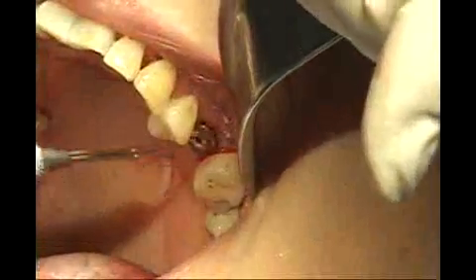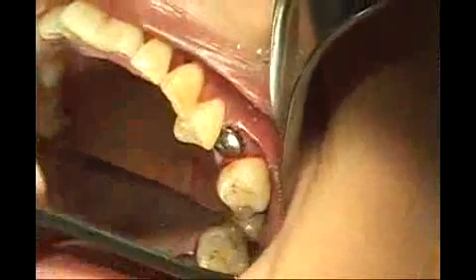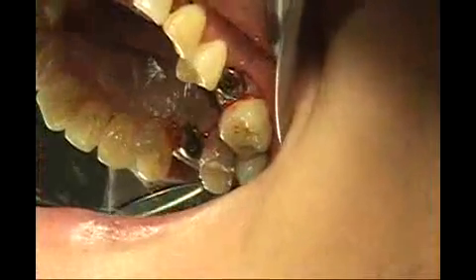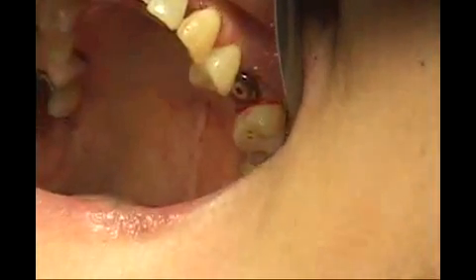Okay, and so because we're 3 millimeters down, the healing abutment should be fairly flushed to the implant, to the tissue, which we are here. And because it's nice and flared, it uses up most of the socket, which means that we don't even have to suture. Okay? And the patient can go just like that.